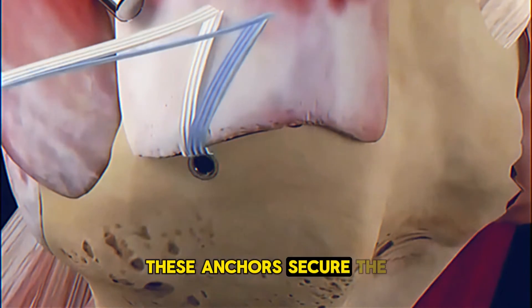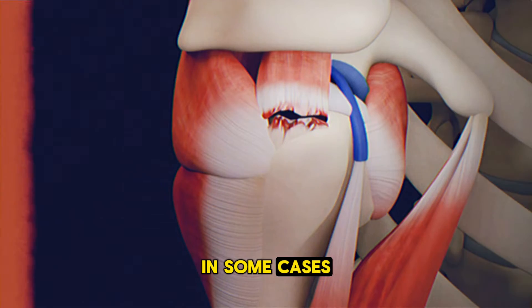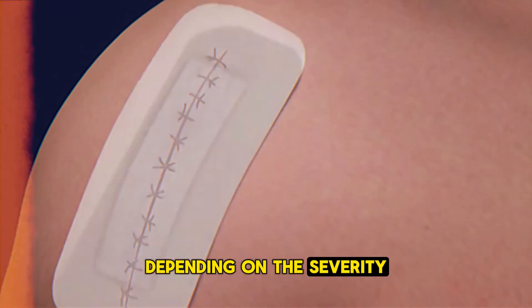These anchors secure the tendon in place while it heals. In some cases, the surgeon may need to trim damaged tissue or perform additional procedures depending on the severity of the tear.